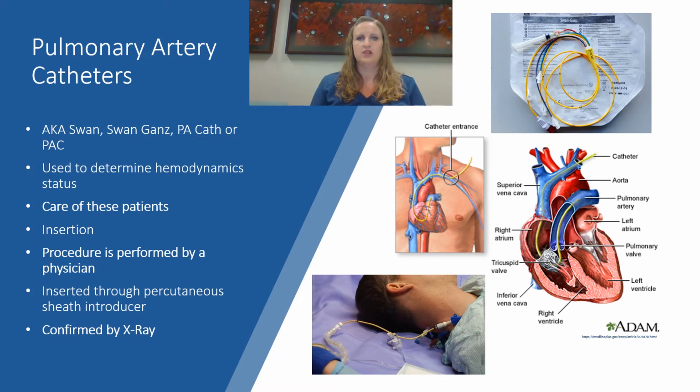Care of these patients should be in a critical care unit, as additional training is required to manage these catheters. They are inserted at the bedside. They can be inserted in the OR, and also they can be inserted in the cath lab. The procedure does need to be performed by a physician with the assistance of the bedside nurse if it is done at the bedside. The catheter is inserted through the use of a percutaneous sheath introducer, and after insertion, the correct positioning needs to be confirmed by X-ray.